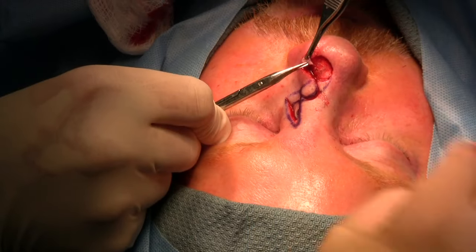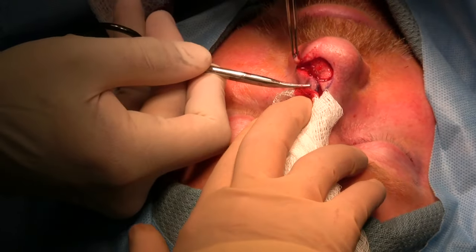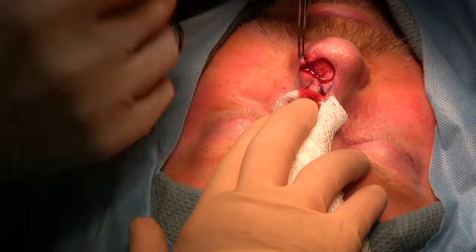This is the dog ear, or the standing cutaneous deformity, removed at this end that will facilitate moving the first part of the flap over into the defect.